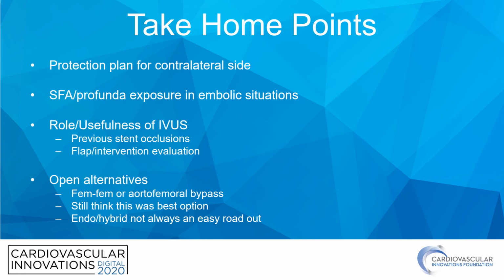The role and usefulness of IVUS, especially in cases of previous stent occlusions: we did briefly consider whether our wire had gone in and out of the various stents that were already in there. I think with IVUS, we could have saved ourselves some time because we would have seen the anatomy of the in-stent stenosis and probably stented this straight out. Plus, we would have felt comfortable that we were within the stent lumen for the entirety of our course.